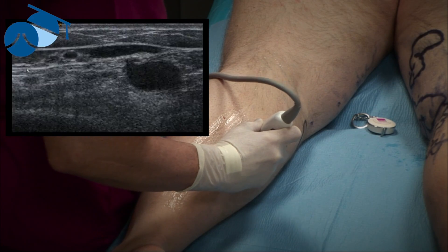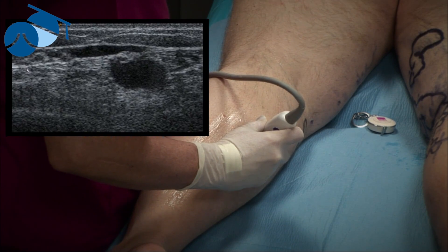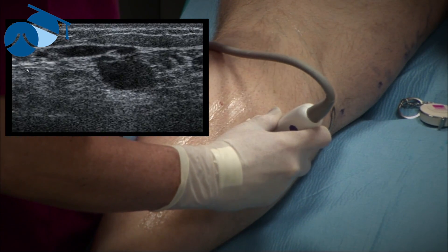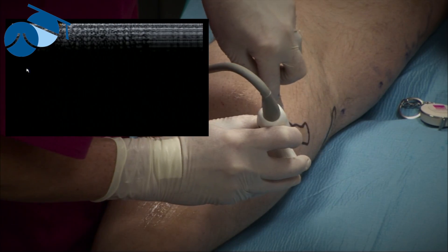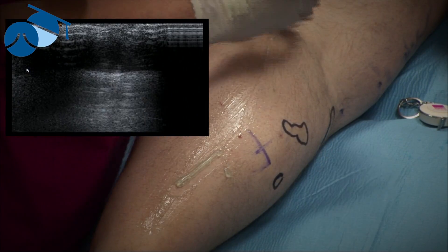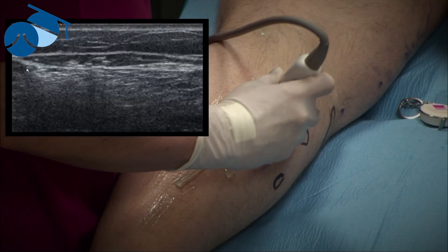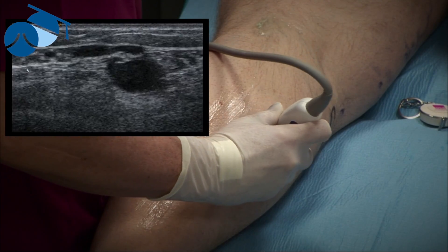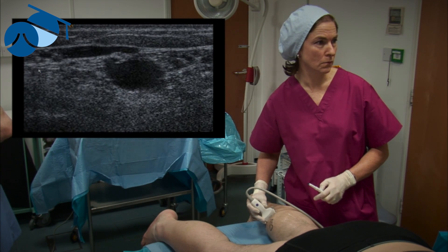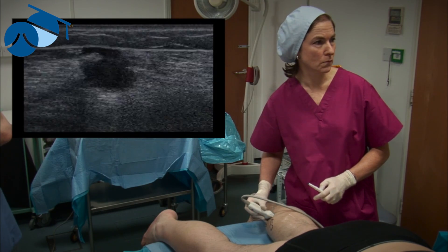We know from our previous diagnostic duplex that it's not incompetent at this point. However, what we do find is this very large incompetent perforator that's feeding into the small saphenous vein. If this perforator is left, it's actually going to start corrupting the small saphenous vein with time. So although we're not going to treat the small saphenous vein in this instance, what we are going to do is destroy that perforator using the TRLOP technique — a simple pinhole technique where we can come straight into that perforator and thermo-ablate it, protecting the small saphenous vein and stopping the reflux of blood on walking.